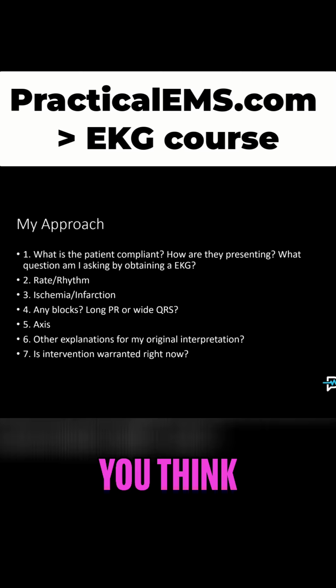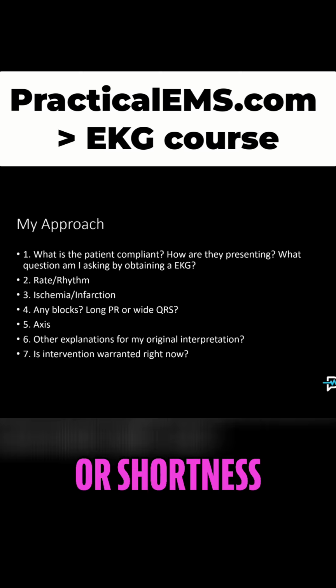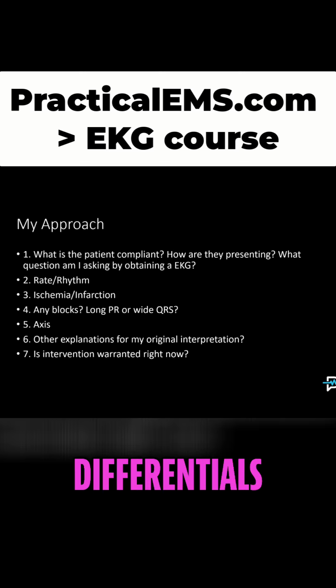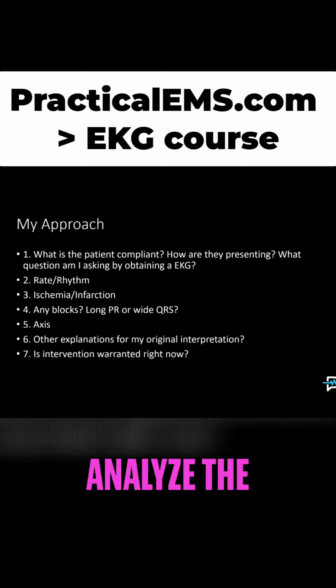And when you think about the patient's chief complaint, are they complaining of chest pain? Are they complaining of palpitations or shortness of breath? All these different chief complaints bring different differentials to your mind that you're going to analyze the EKG based on.